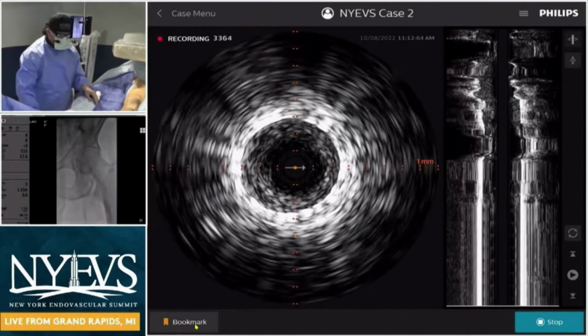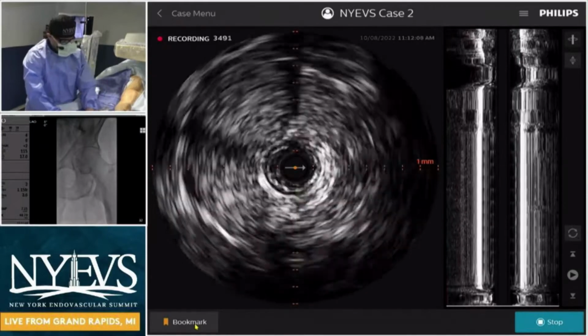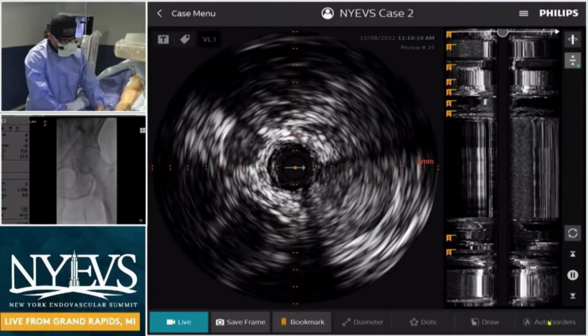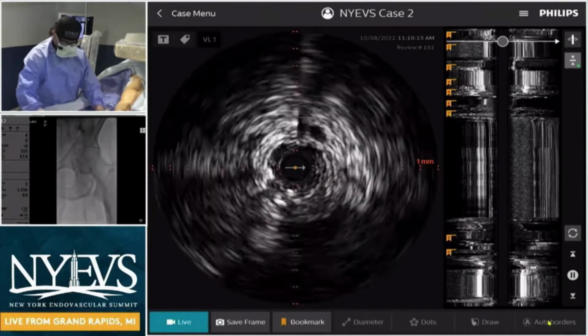Shadi, what do you think? I think you're seeing soft plaque here, so that's one thing to consider. The other one is you're seeing ISR. So I think that limits you to laser versus possibly JetStream or Rotarex. Okay. I'll probably choose one of those three.